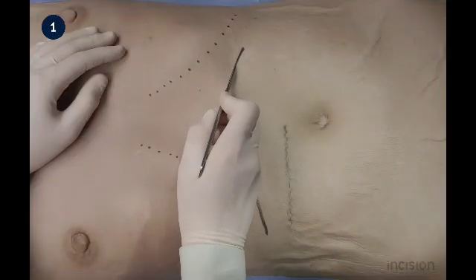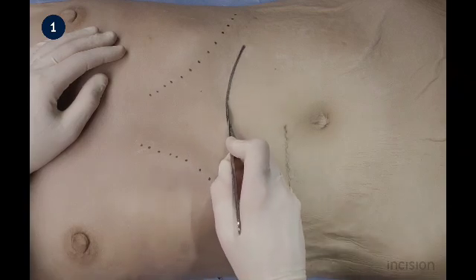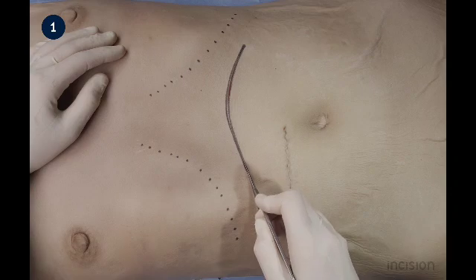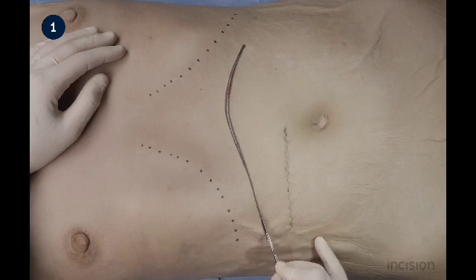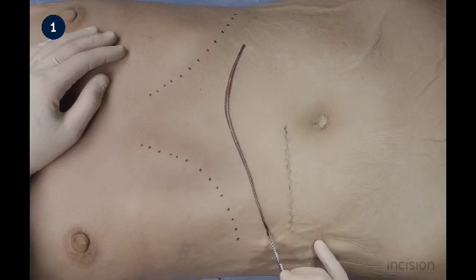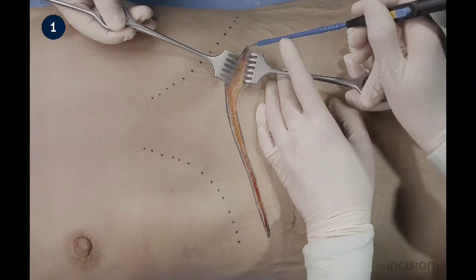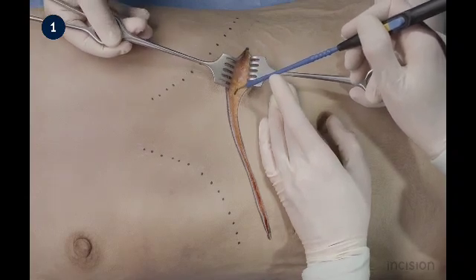The line of incision of the transverse upper laparotomy is curved and placed under the costal arch. It can be shortened medially or extended laterally according to the required exposure. The subcutaneous tissue is dissected with electrocautery until the anterior rectus sheath is reached.